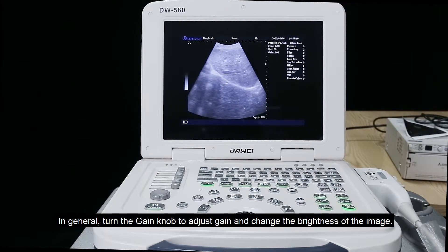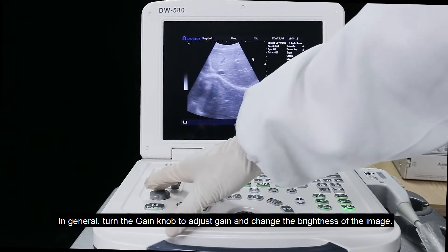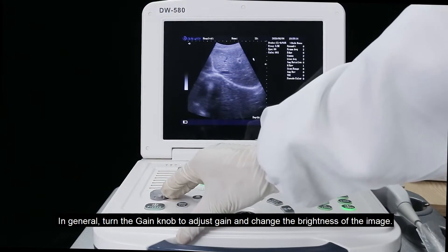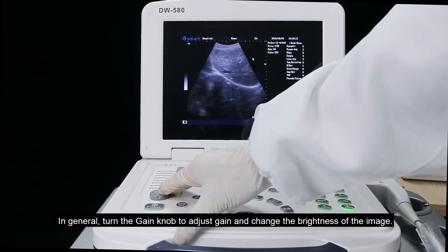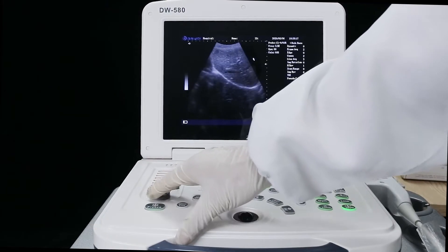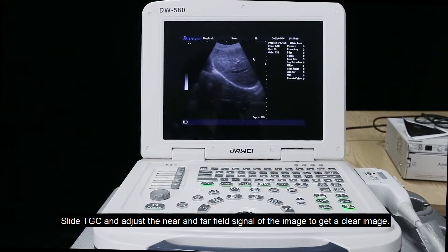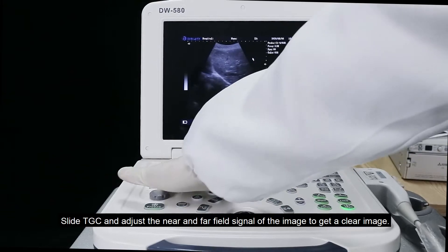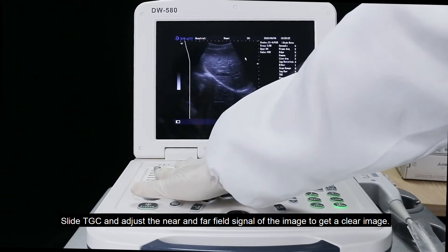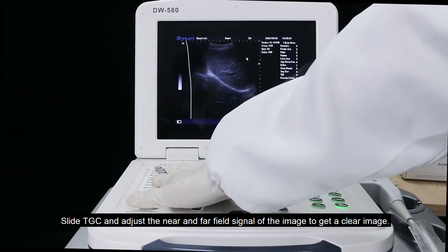In general, turn the gain knob to adjust the gain and change the brightness of the image. Slide the TGC and adjust the near and far field signal of the image to get a clear image.